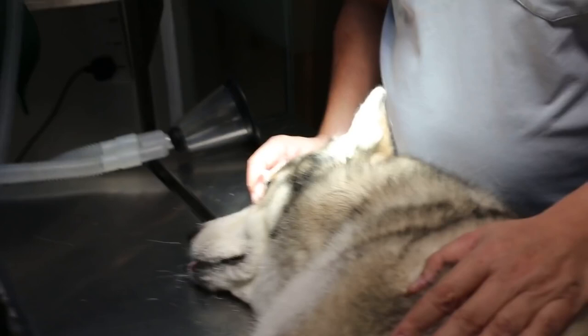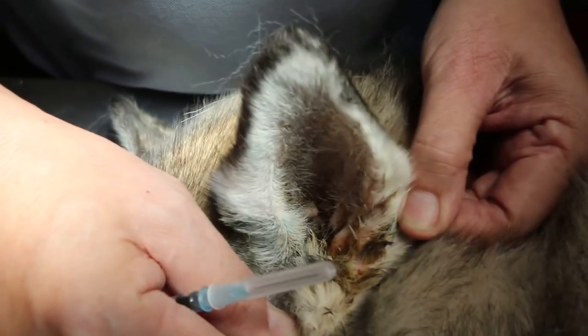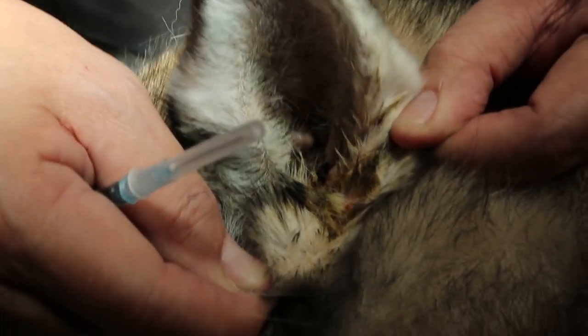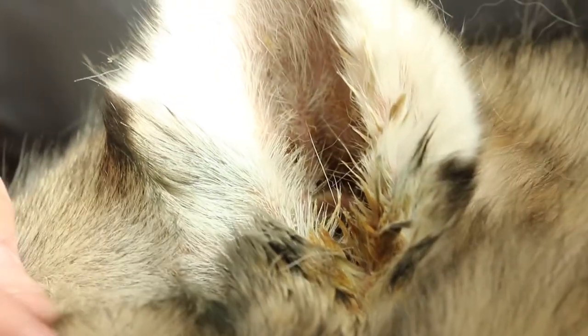This is a case of chronic otitic external. The treatment of this very bad infected ear — pus inside the ear canals, smelly and painful — is by ear irrigation. To do that, the dog has to be sedated first.